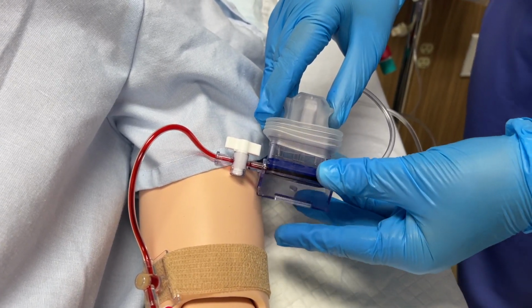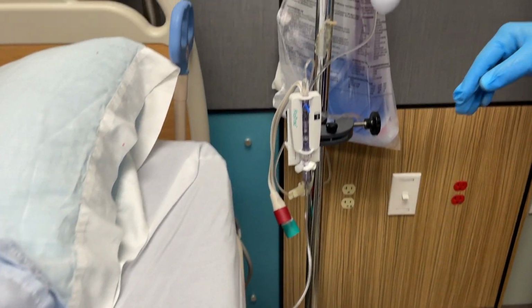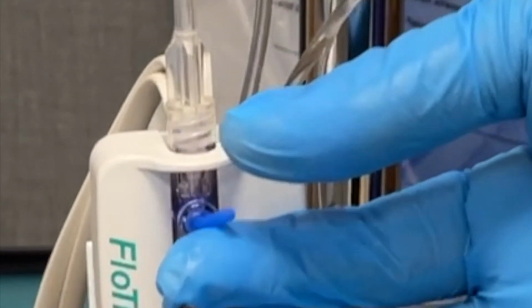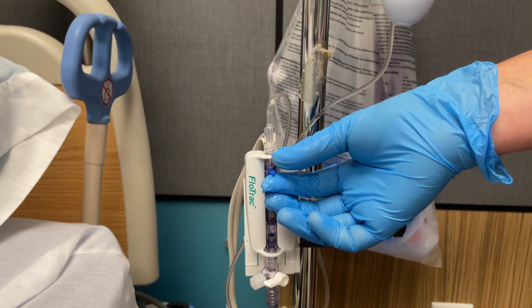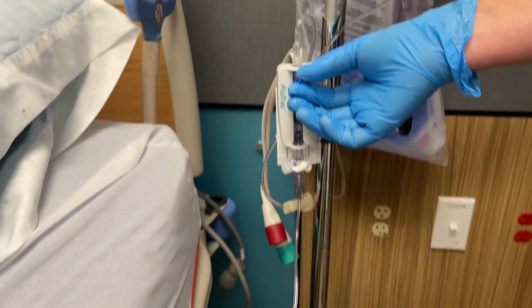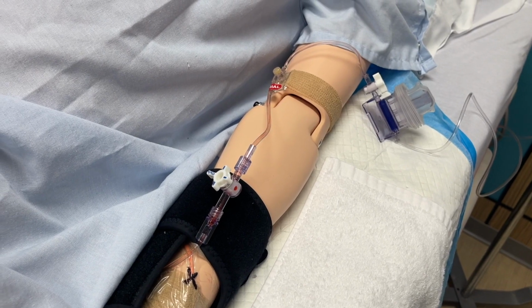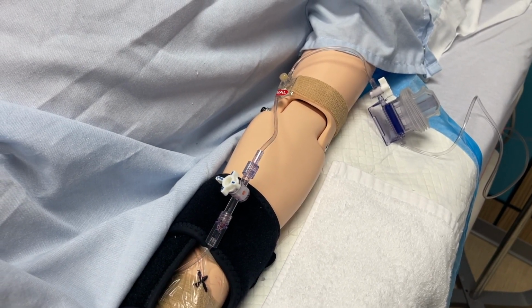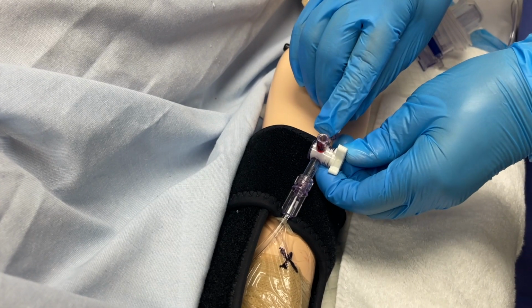Once the waste has been given, we will use the transducer set in order to flush the line, very much like before. With this transducer, you will note a blue elastic device called a pigtail. We will pull on that to activate our flush. Again, we will flush the line until all blood is cleared and the tubing is completely transparent. Again, we will still have blood collected in the port designated for air on the lower stopcock.